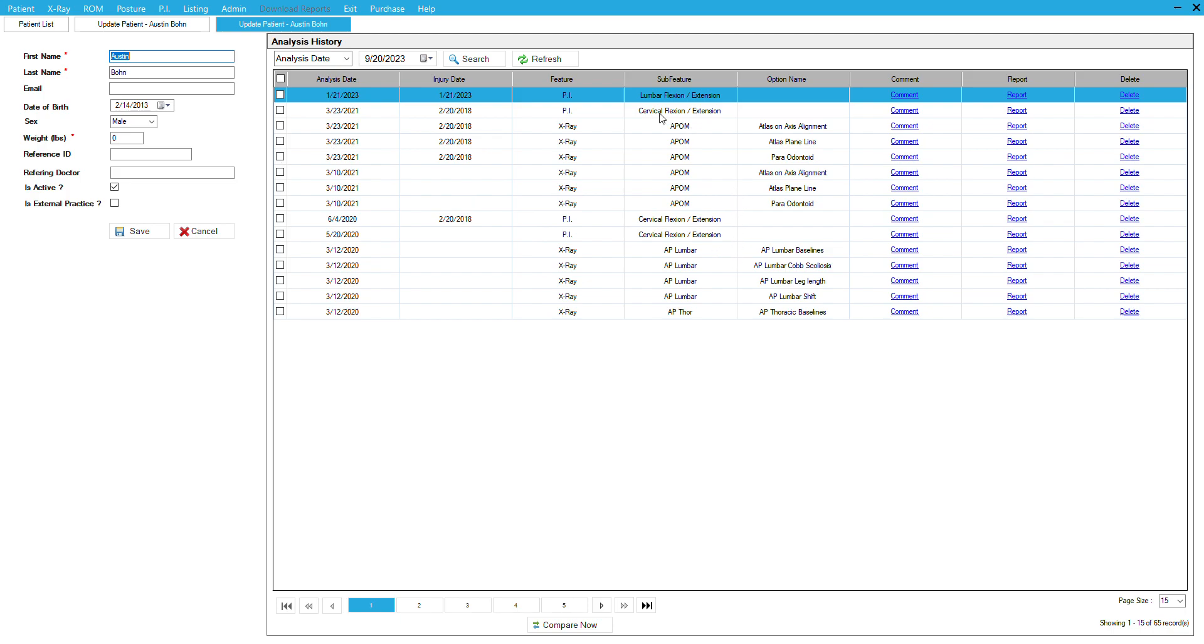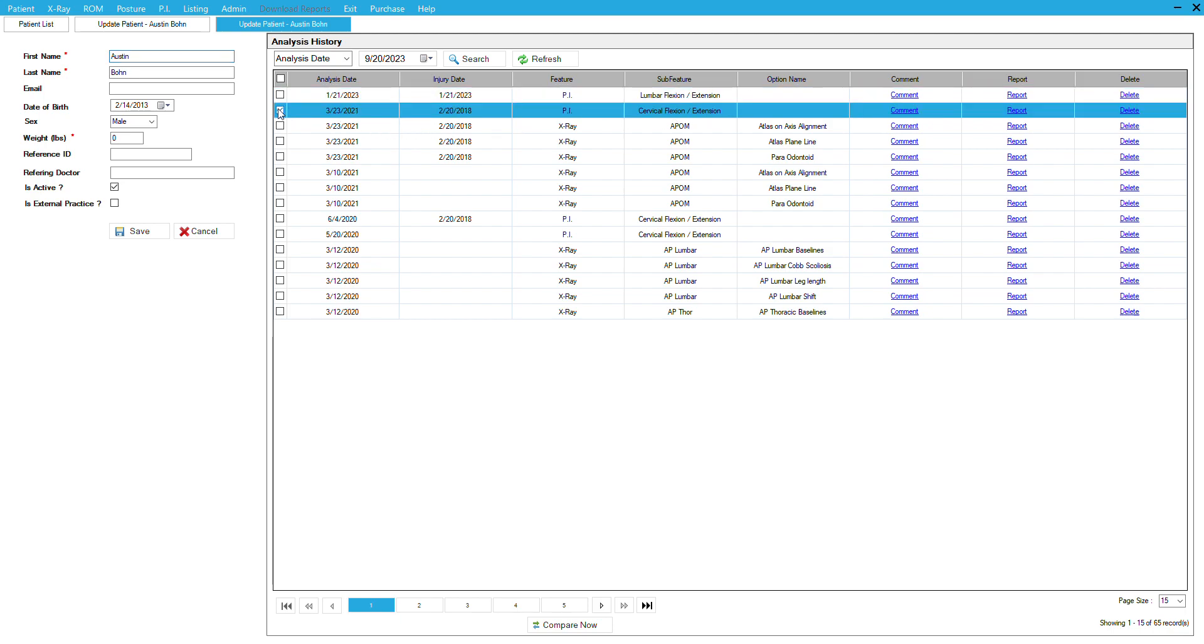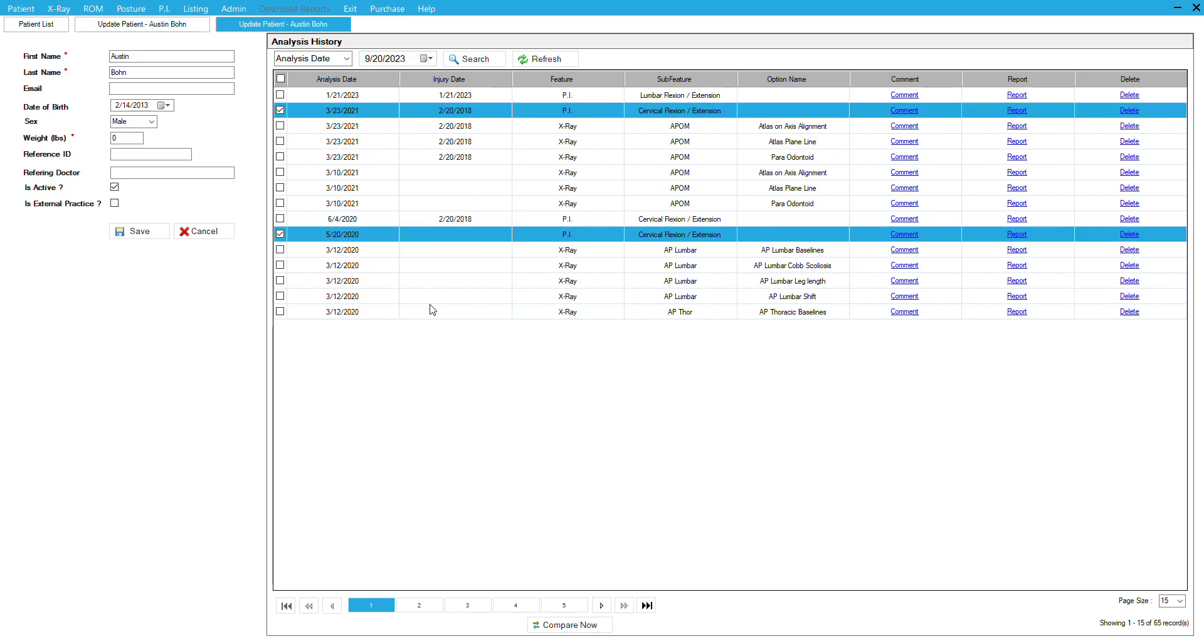In this case, we're going to take this study, the cervical flexion extension, and select it. Then we'll come down here to this flexion extension study on 5/20 and select it. With those two selected, we come down to the bottom and click compare now.